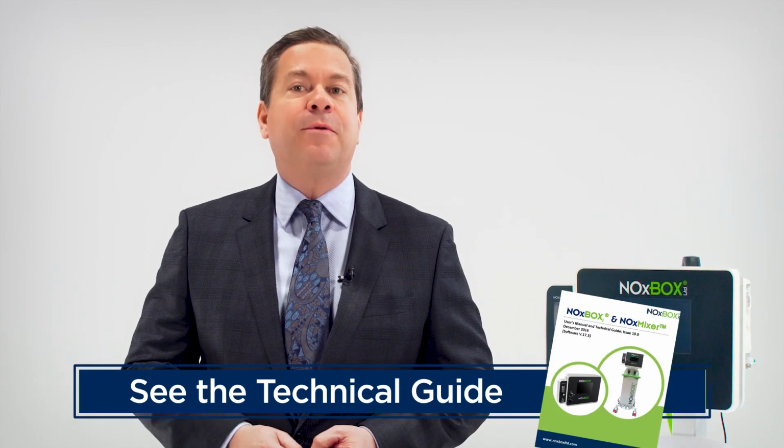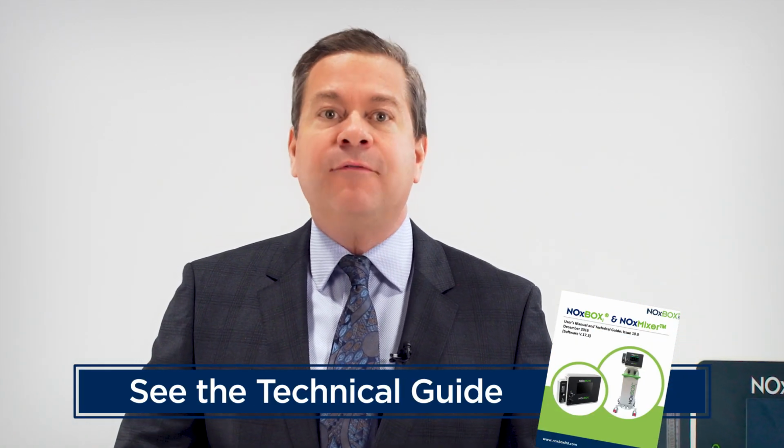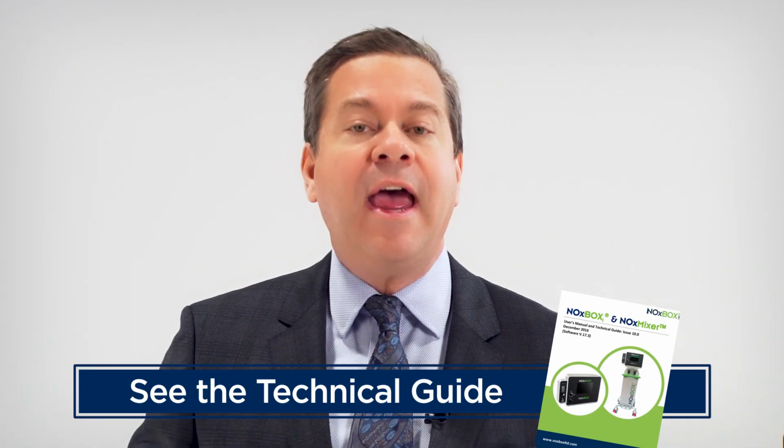The content of this video is intended to provide general information only. Read and always refer to the latest NOxBOXi and NOxMixer technical guide for specific information, procedures, instructions, recommendations, and troubleshooting. In the event of any inconsistency between the content of this video and the NOxBOXi and NOxMixer technical guide, the technical guide prevails.